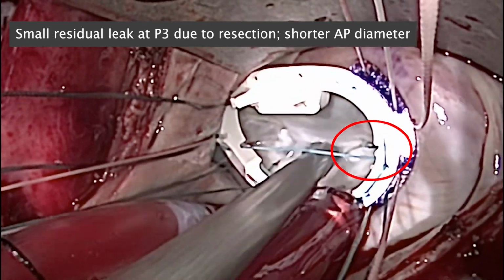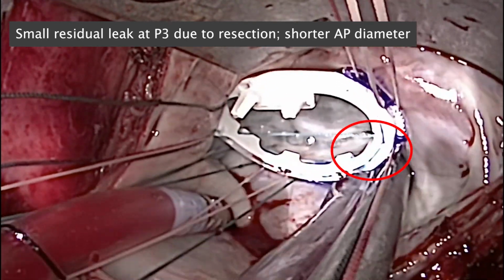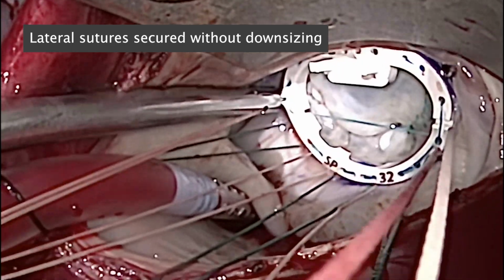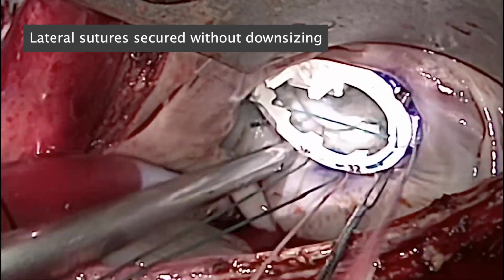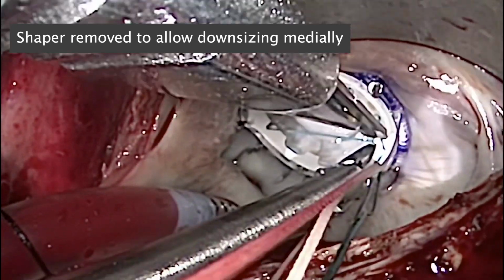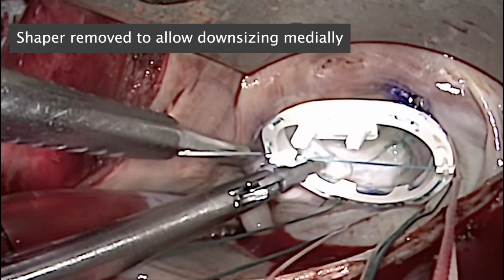You can see upon retesting before we secure the ring that there is still a leak medially, and we'll want to optimize that. So on the lateral side, we keep the shaper on to make sure we don't downsize the ring too much. The patient had a small coaptation to septal length of less than 2.1 centimeters.